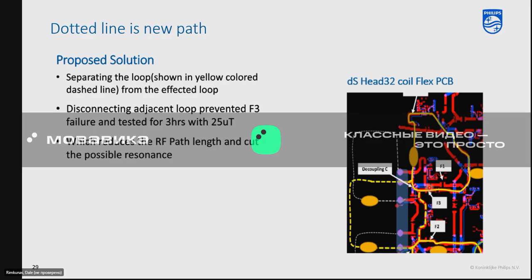Was there also a video on how to open a 32-channel head coil? There is one. There's an older one that shows you how to open it. There's a newer one that I'm still working on that is showing you how to open it, but also goes into detail about inspection. So there is one about opening it, yes. Okay, good. But there will be more. Yeah.